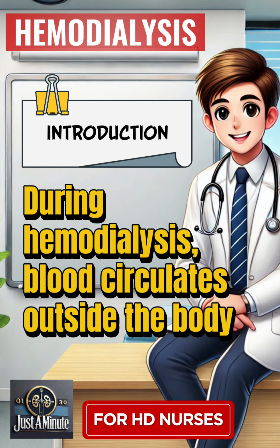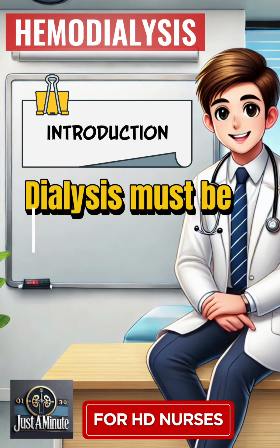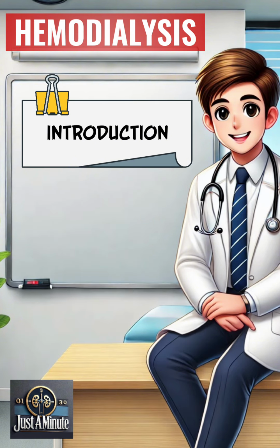During hemodialysis, blood circulates outside the body through an extracorporeal circuit. In certain emergency situations, this blood becomes unsafe for reinfusion. In such cases, dialysis must be terminated immediately without returning the blood to prevent serious or fatal complications. Let us now discuss the three important situations.